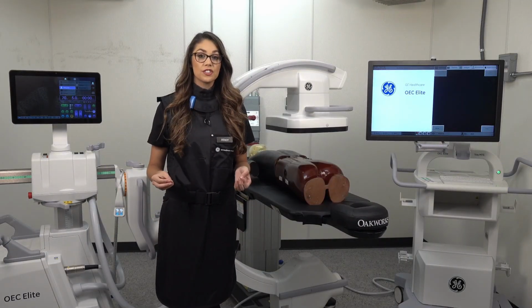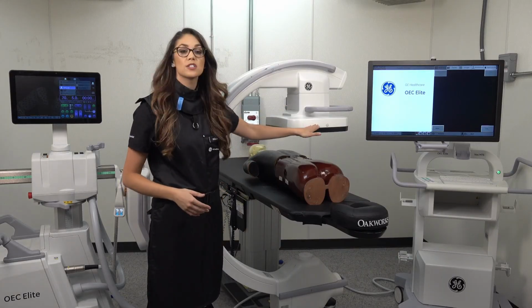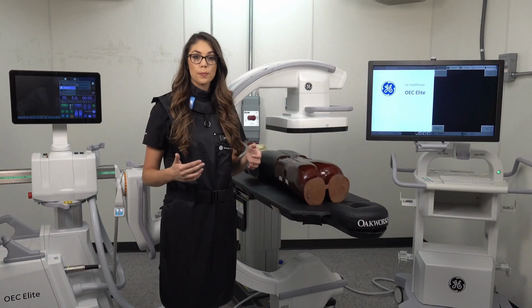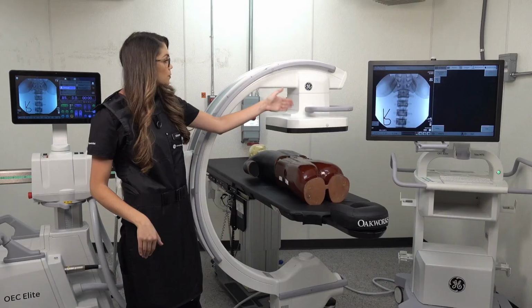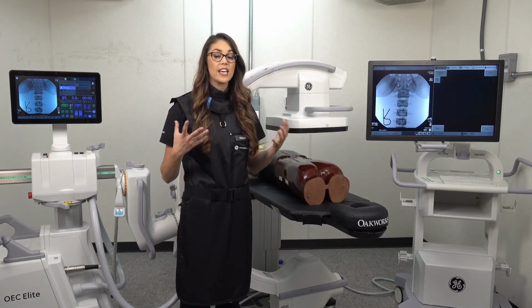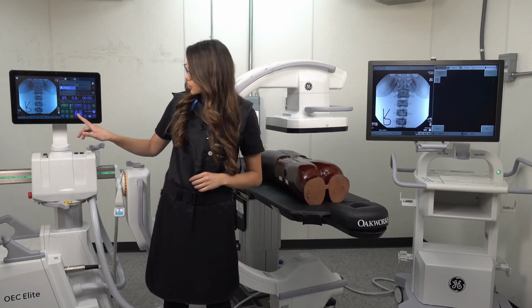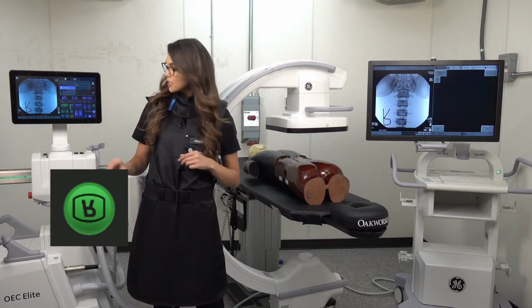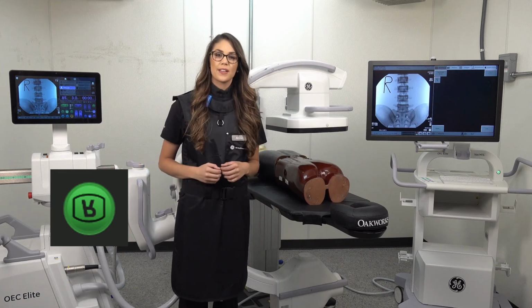Now for this procedure, our patient is facing prone, but their head is away from our smiley face indicator. We'll want to orient our image, but let's first take a picture, see where we're at. Just by looking at this picture, you can see that it is upside down, so we've got to anatomically orient it. The way that we would do that is by going to our touch control panel and looking for the upside down R matching our indicator. Once that is selected, our image is now anatomically oriented.